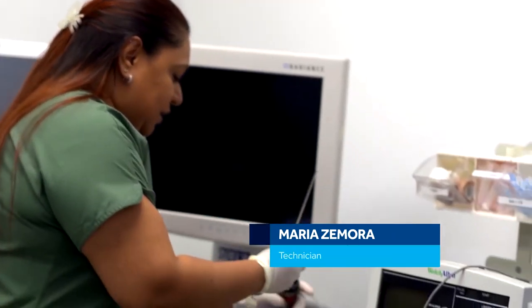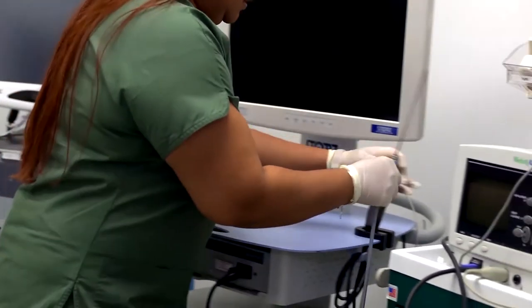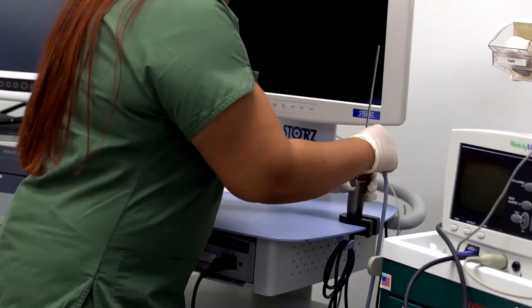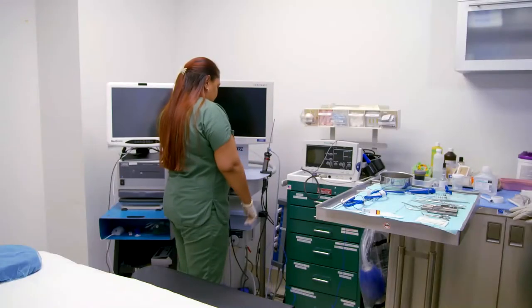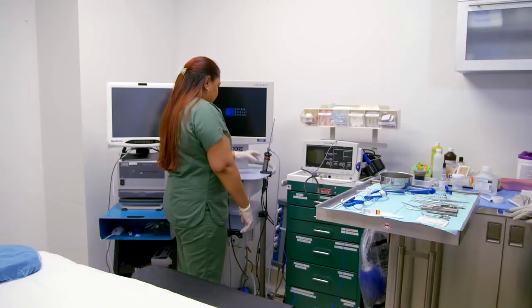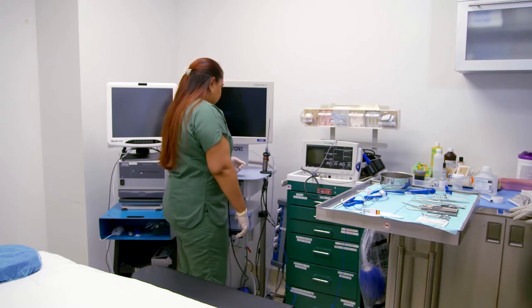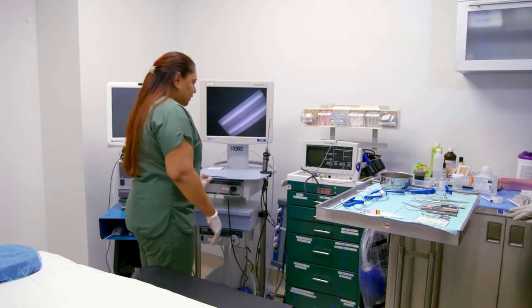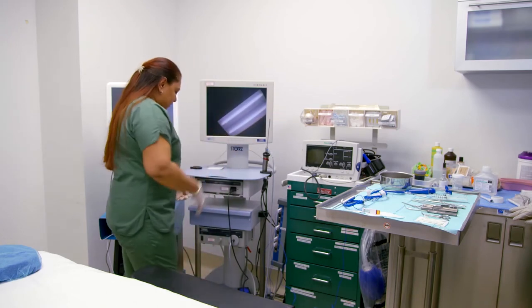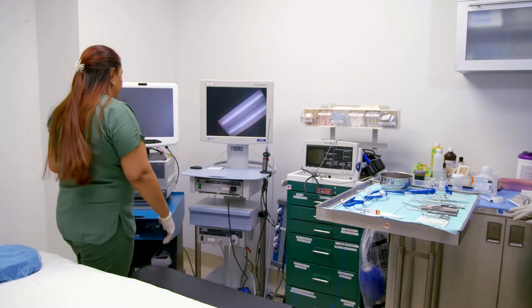Right, so once Jackie's set up, I usually come and I put the scope into the camera and connect it to the light source. We'll put up her screen. Just make sure that the camera is capturing so that when the doctor comes in and she'll bring the patient, we'll just have everything ready. I will not turn on the light right now, only because it will get hot if I do.